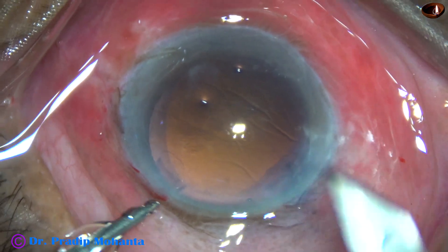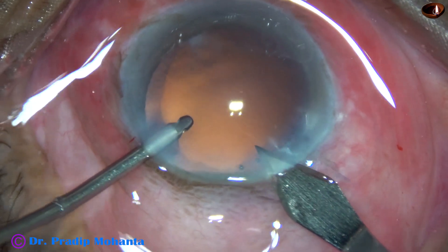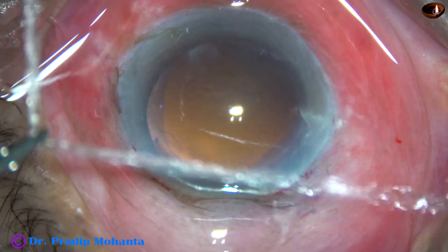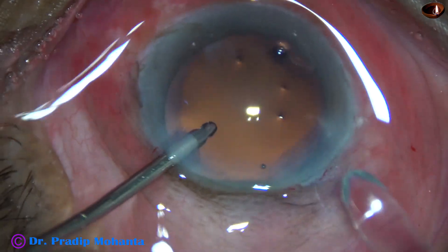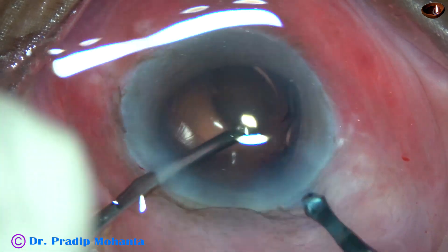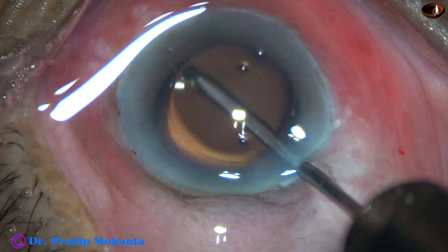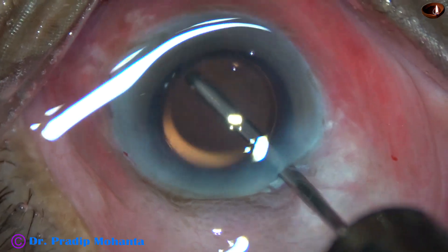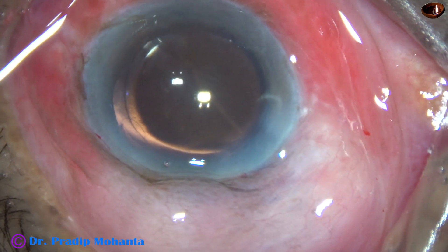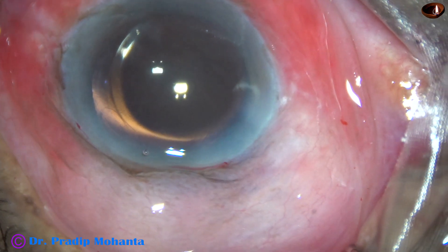In this case, I am going to use a bimanual cartridge, so I am going to enlarge the main wound a little bit — the 2.8 mm wound becomes about 3 mm. Now the tip of the cartridge can go into the anterior chamber, and the intraocular lens is safely delivered in the capsular bag. Otherwise, the lens may get stuck at the wound if we try wound-assisted delivery without enlarging the main wound. The eye is a bit deep-seated and there is some fluid collection over the cornea at times.